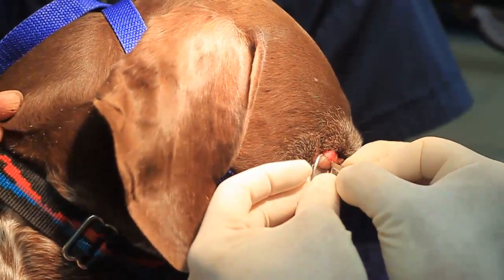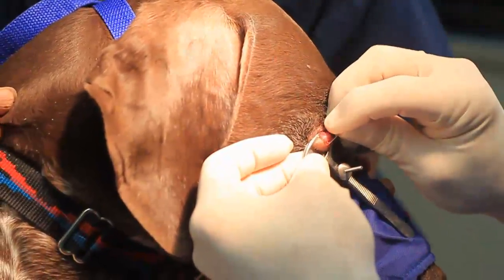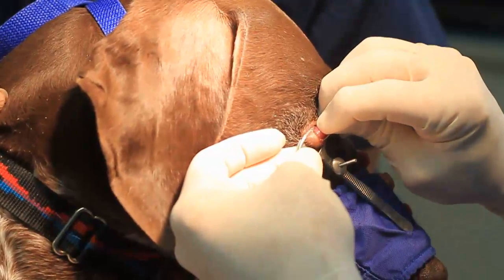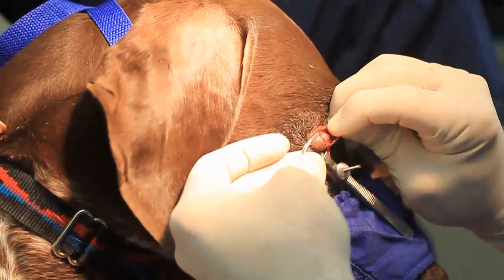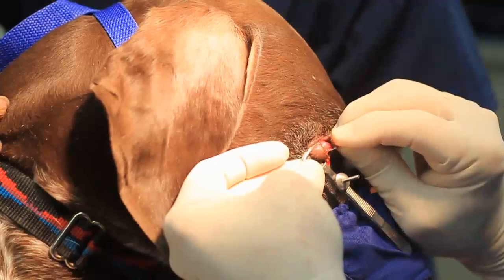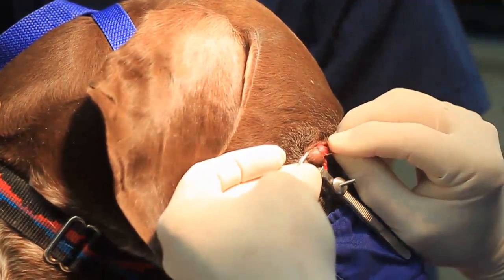That's right at the eyelid margin. I start there because I want to be really careful that I don't create much of a defect. Then we're just going to scrape this tumor right out of here.